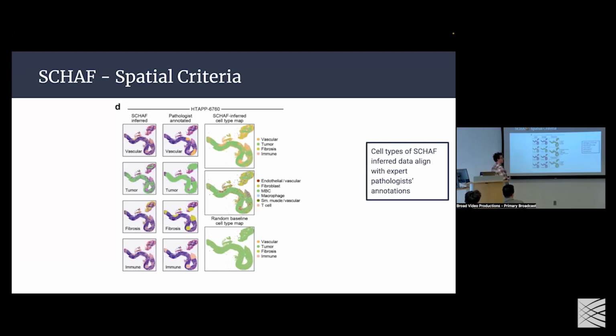And you might be thinking, oh, that looks very pretty. But here's the catch: pathologists did the same thing. They looked at the histology stain and said, that region is this cell type, that region is that cell type. These people go to medical school for many years, do residency for many years after that, and work in the clinic. And the pathologist said that, more or less, these two align. So I take his word for it.